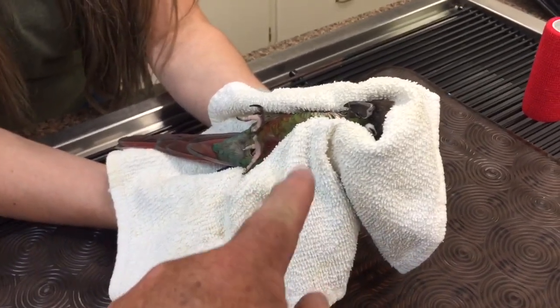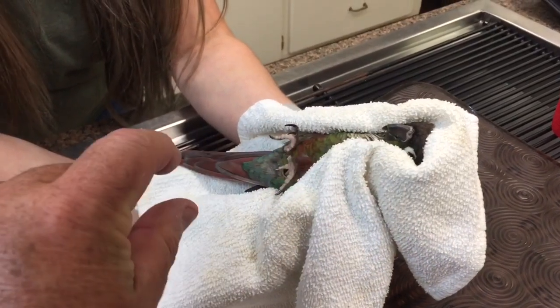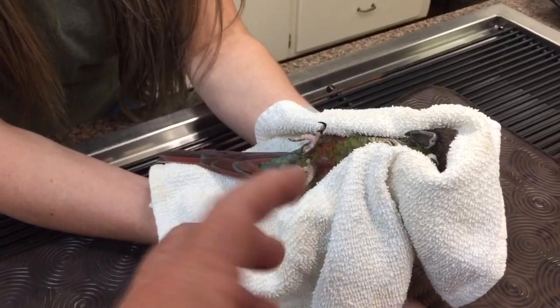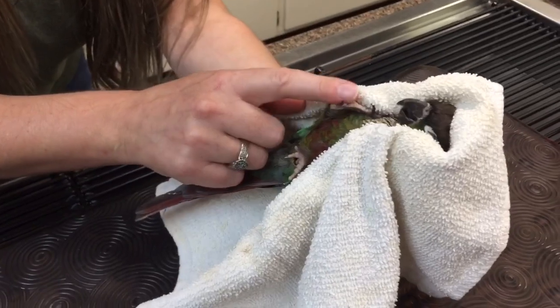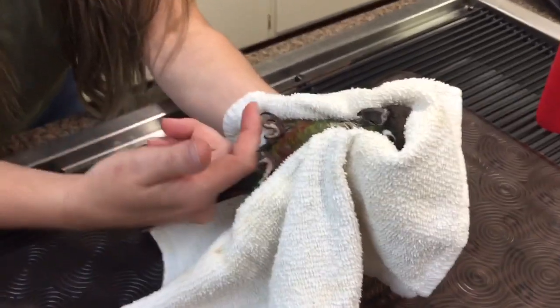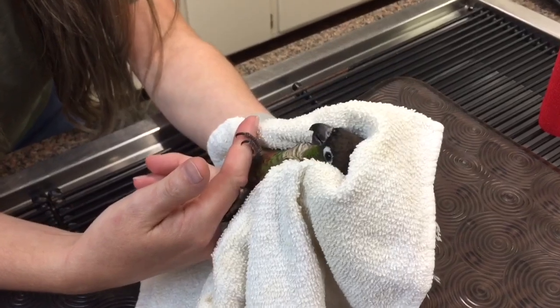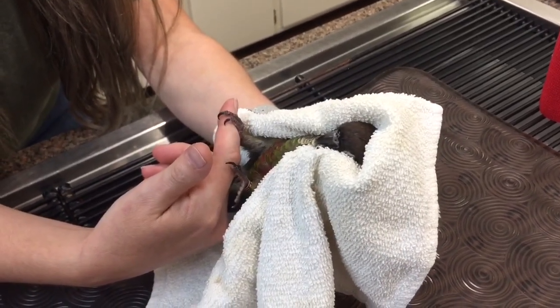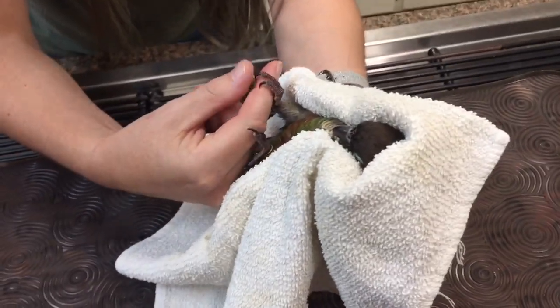The way it works is it actually goes around — there's a little ring that goes around the hip joint itself and then extends out on both sides of the leg, both up front and beyond. It actually connects several places where we can tie the leg in and put it in traction in whichever direction you want. But right now, this is what the bird looks like. In a minute after I start manipulating, the bird's going to get yelling and screaming. So for you birds in the ears out there, I don't want you to hear a bird cussing. We're turning the camera off and in a minute you're going to see me splinted.